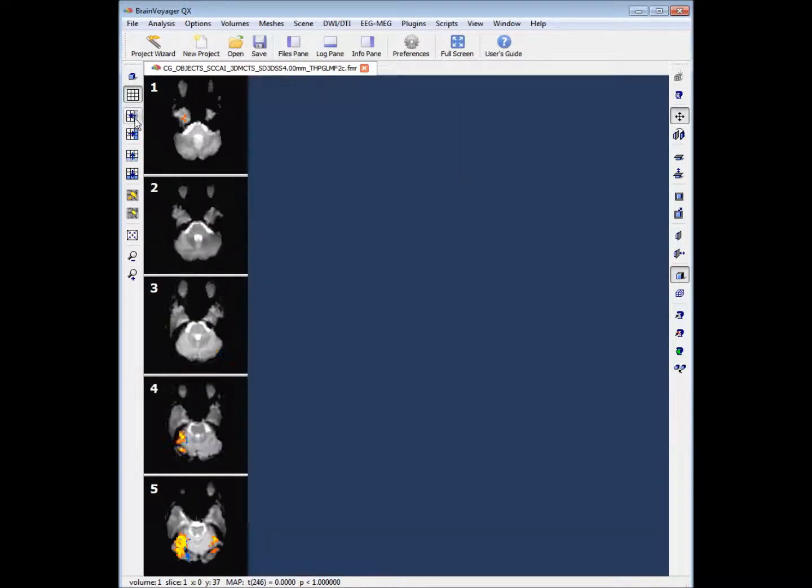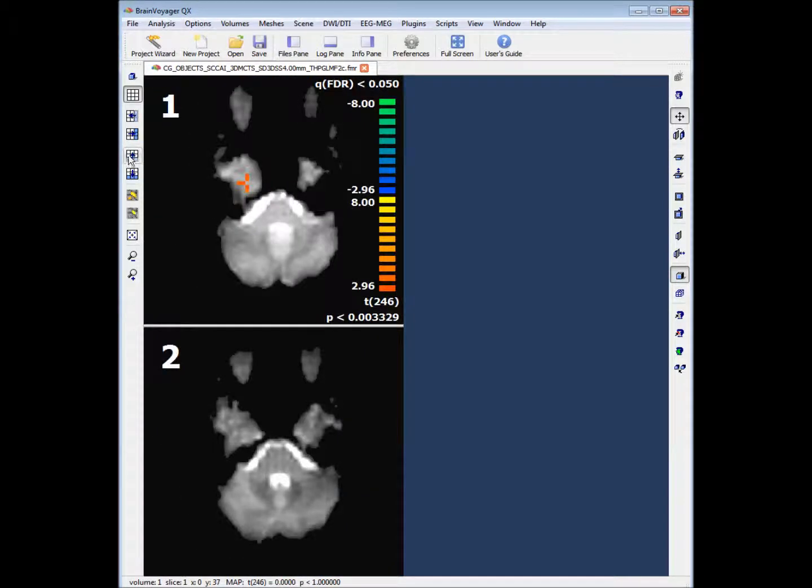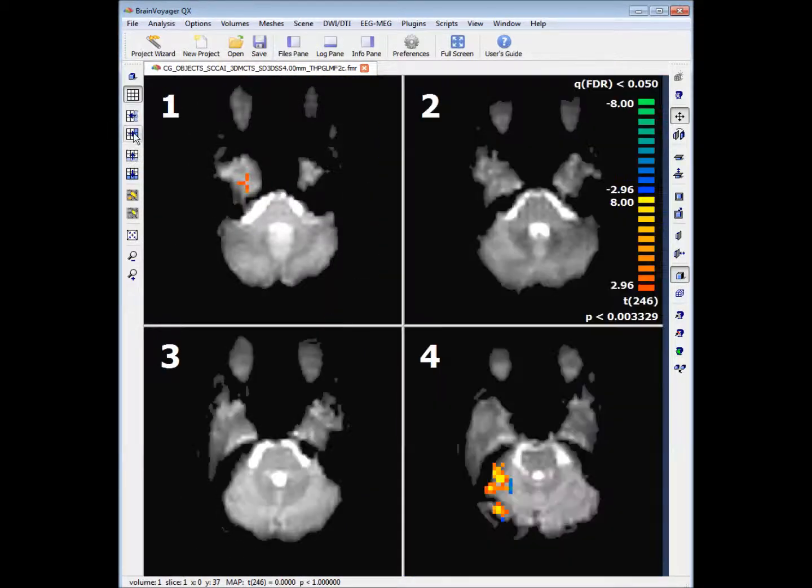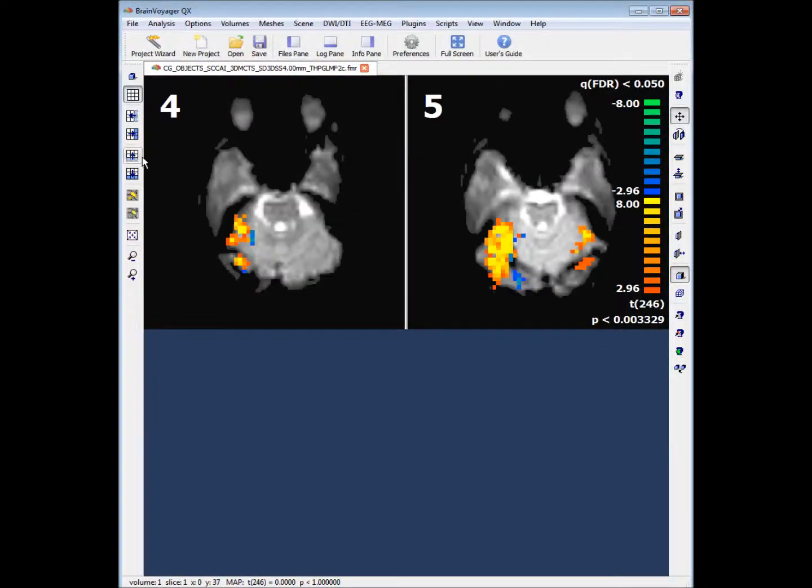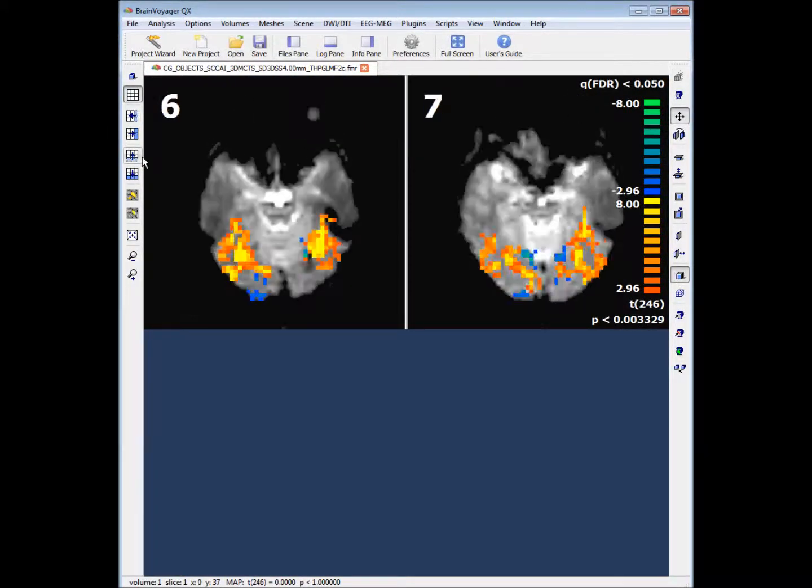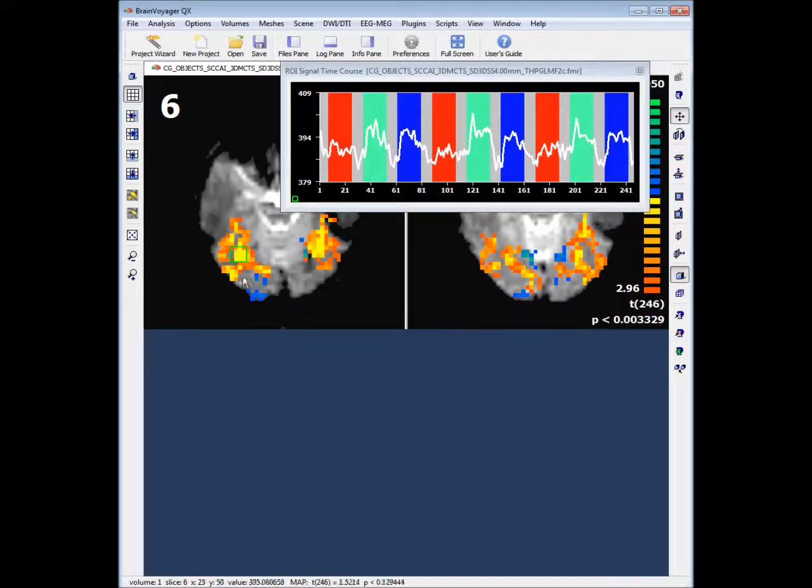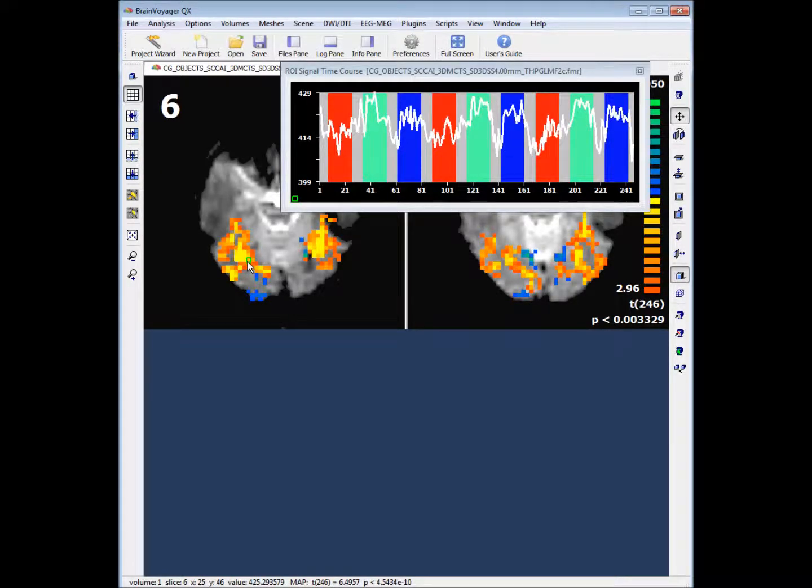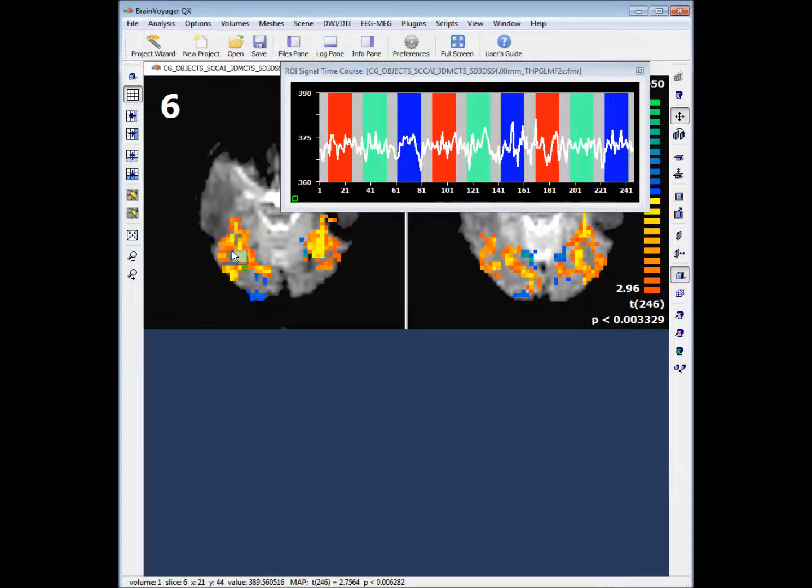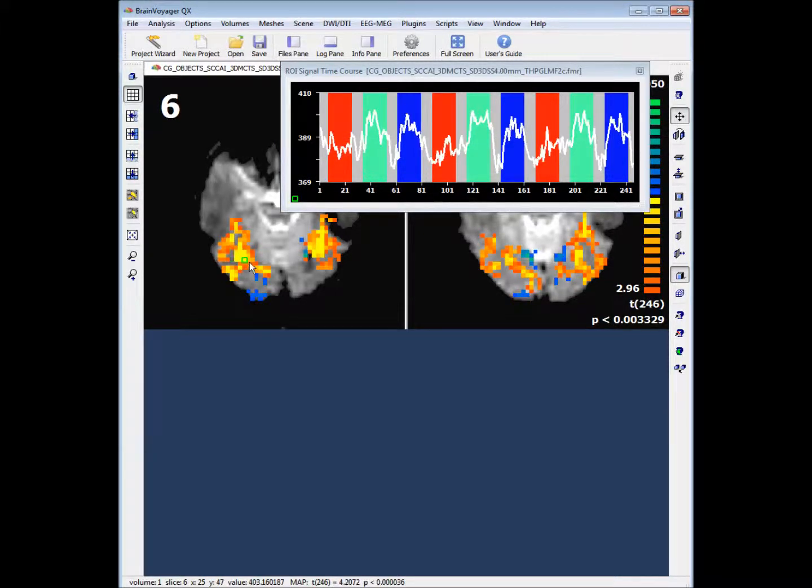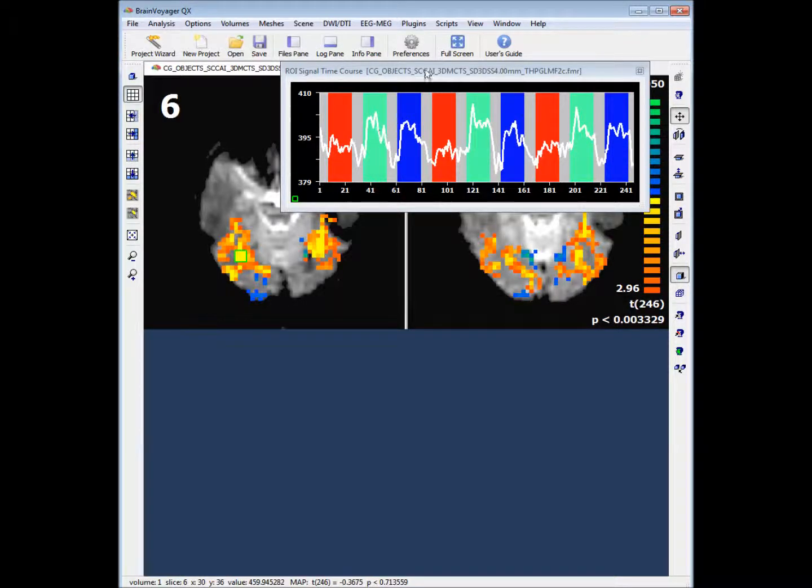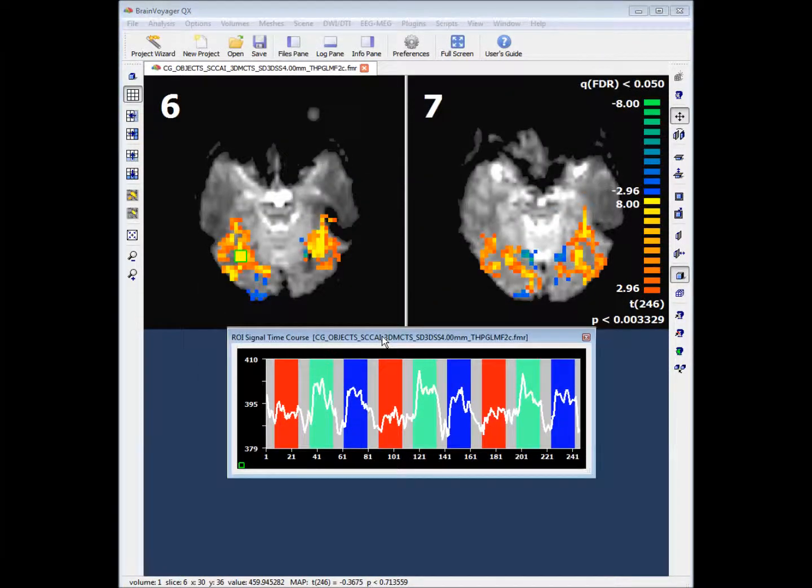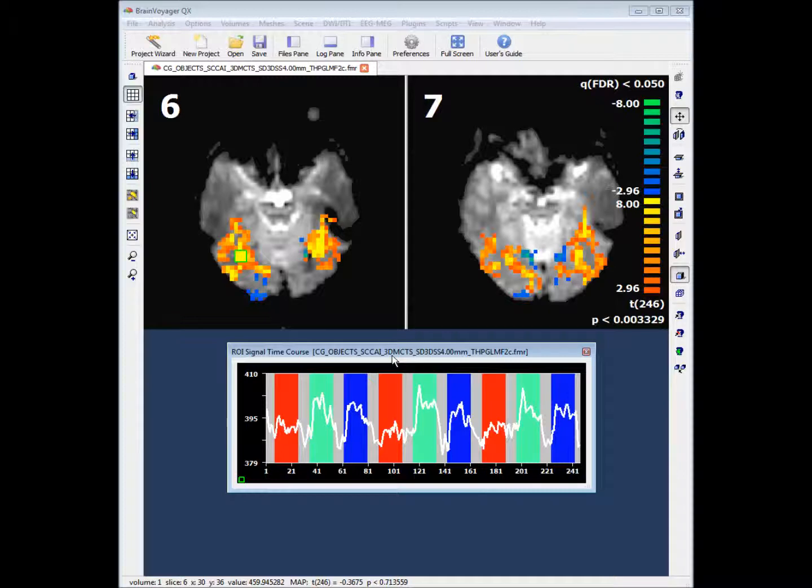We want to focus on slices 6 and 7. We want to define a region of interest. If we select the area that looks like a yellow square on slice 6 in the right hemisphere, it may take you a few tries to get this properly. But once you have it you should have your average time course for all the voxels and your region of interest displayed in the signal time course.